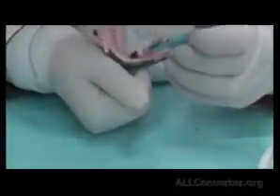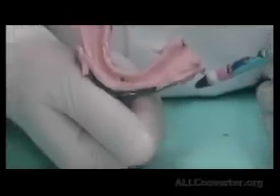Once more, the sulcus here is not continuous. The roll is missing, so the lingual side needs more material to be put in. And we have another pressure spot here. So this impression might not have fully seated into location while inserting it.